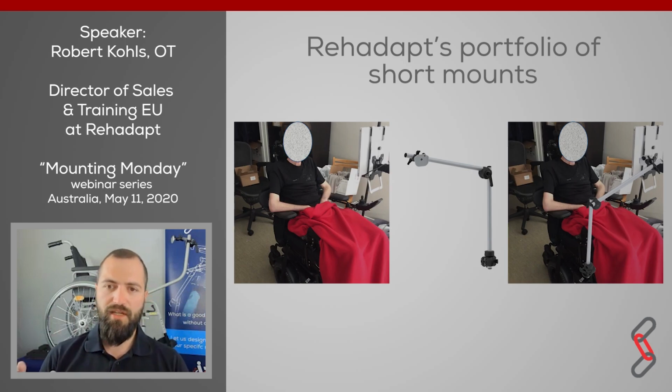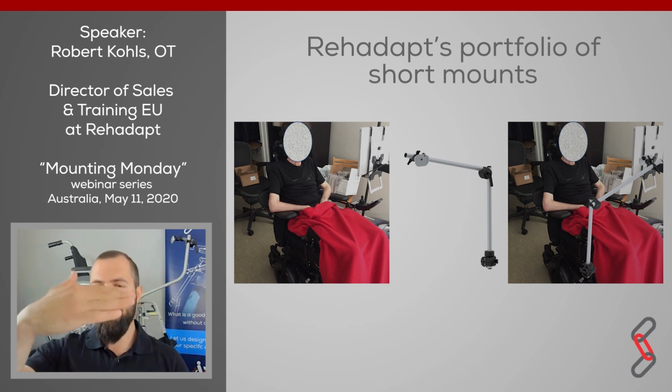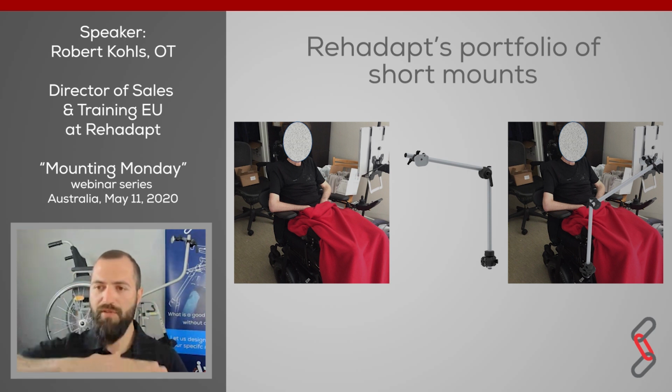This is a customer example from someone with ALS who requested a very, very easy solution for an iMobile in combination with his power chair. He wanted a frame clamp attached to the side of his wheelchair, with only 2 tubes. One tube comes from the ground upward, and the other tube goes in a horizontal position to position the eye gaze system well enough.